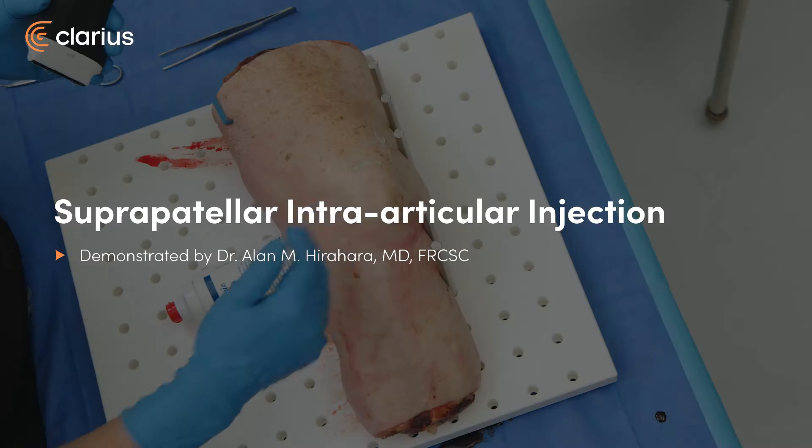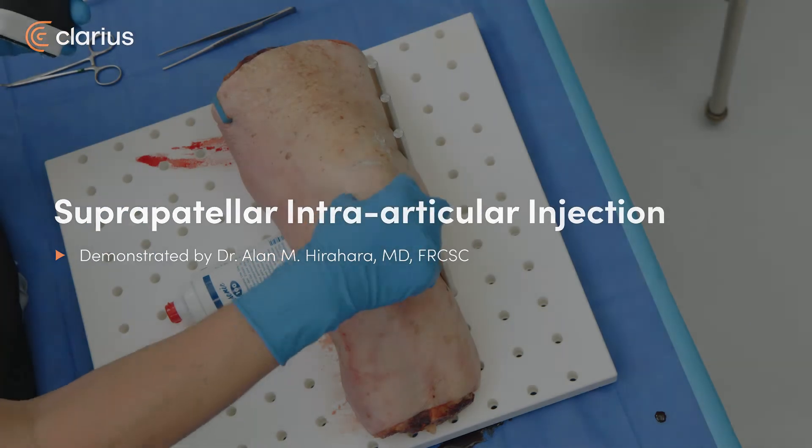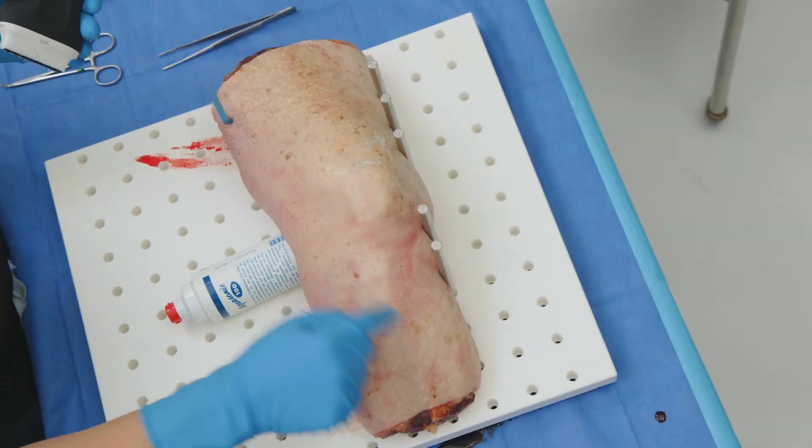We're going to show the intra-articular space. We're looking at the lateral aspect of the knee. This is distal, this is proximal. The patella is there, the tibial tuberosity is there, the fibula is here, and the tibia is over here.